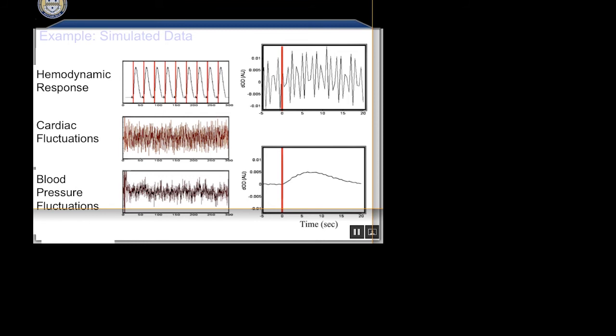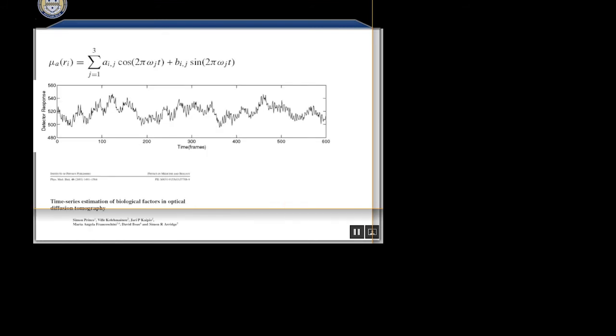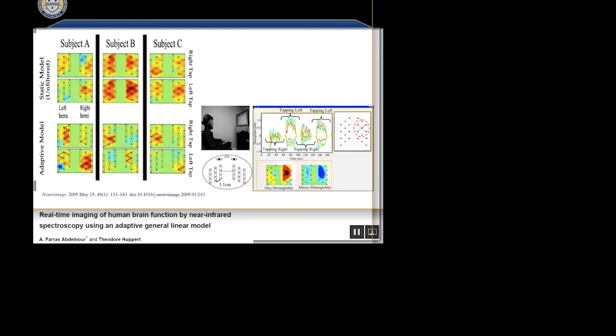And if you're changing your posture, whatever, that's going to change as a function of time. So the way that people get around that is to try to do adaptive models where they allow those transfer functions, those relationships, to evolve over time. You put some sort of restriction that they evolve slowly. So think of it like a sliding window over your data.